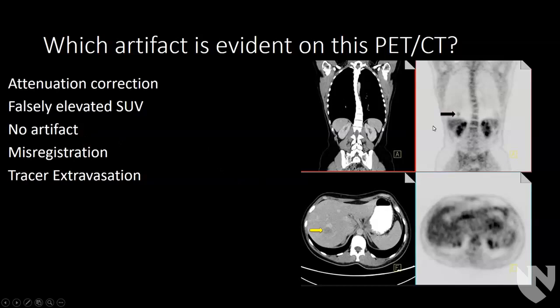What happened is, when the patient did their CT, they maybe took in a deeper breath and their diaphragm moved down. So the liver looks like it's lower on the CT, because then when they do the PET, they're just breathing quietly, and so the metastasis moves up.